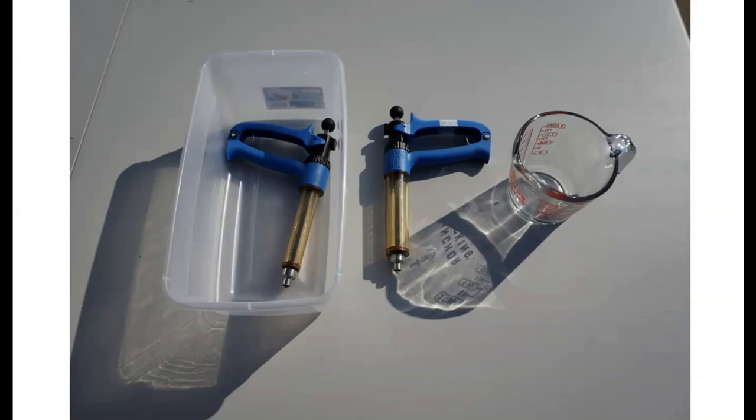when we're boiling water. And once it gets cooled off, I put it back in my plastic container and it goes in the freezer with those syringes. So I only rinse it really good with tap water that first time and then just fill it with distilled water after that. Last thing I would mention here, and I think I said it, but I'll say it again real quick, is just make sure that glass measuring cup, you let it cool off before you put it and the syringes in the freezer.